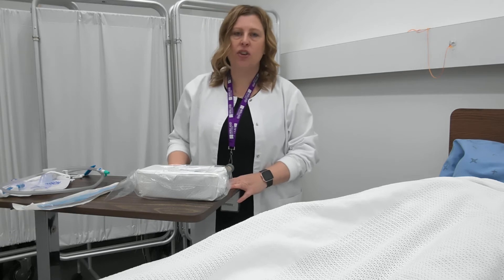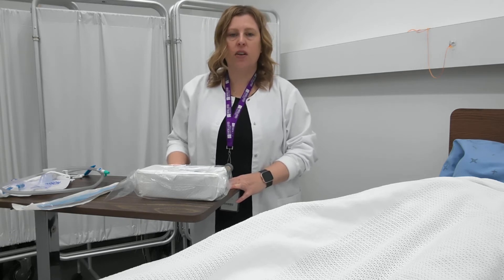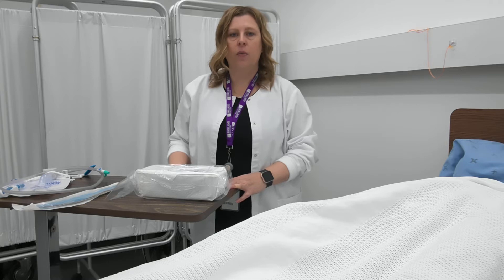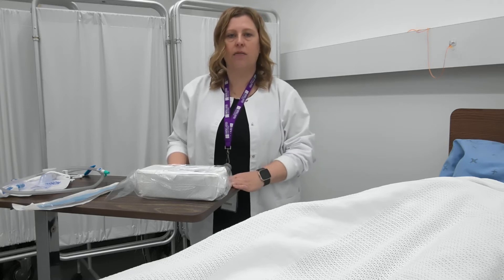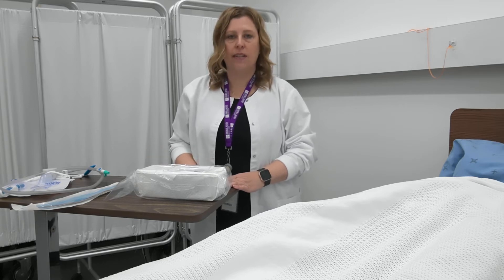Hello everyone. Today's demonstration will be male catheterization. Before we get started, we want to ensure that we've checked our doctor's order, we've looked at our policy and procedure manual, we've done good hand hygiene, and when we enter the room, we're going to identify our client using two identifiers. For this procedure, I'm going to be using surgical asepsis.